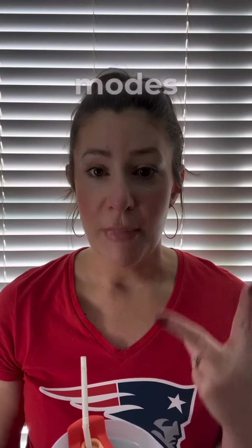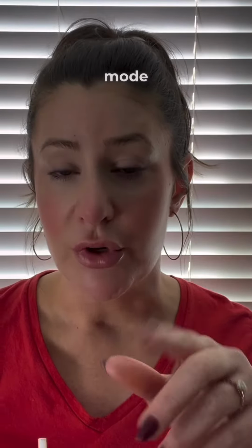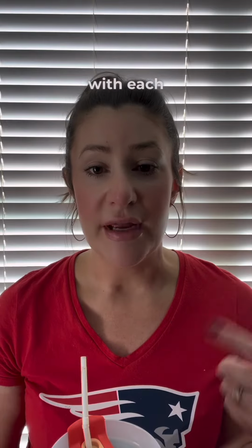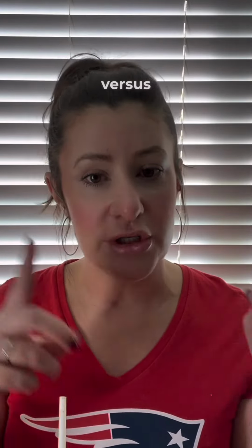When it comes to ventilator modes, there are two broad categories that you need to understand. We have volume control modes and we have pressure control modes. With a volume control mode, the provider sets the amount of volume or the amount of air that's going to be pushed into the patient's lungs with each breath. So we have control over the volume. However, with volume control modes, the pressure is going to vary, and it's going to vary from patient to patient and from breath to breath. And that's very important to remember when you're thinking about volume control versus pressure control.